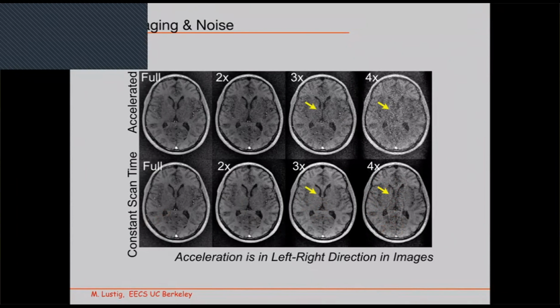But the combination of the acceleration and the loss of SNR could be detrimental. And this is really non-diagnostic. This is non-diagnostic. This is somewhat diagnostic. So that's what you have to be aware of when you speed up.